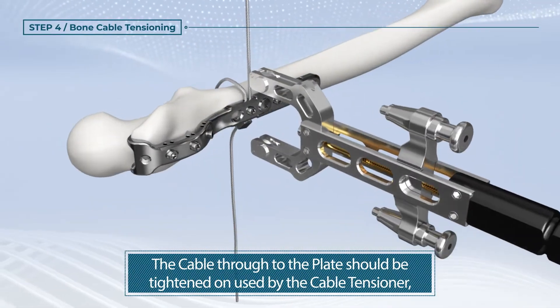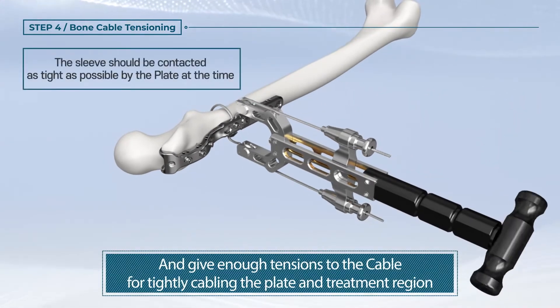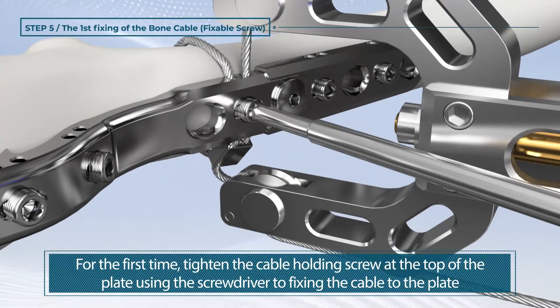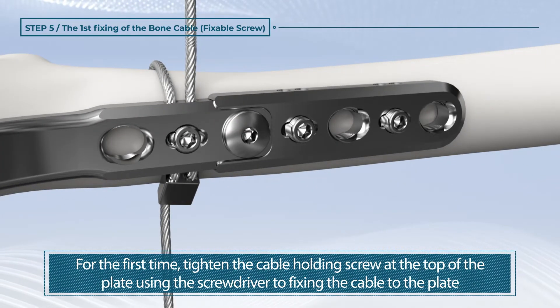The cable through the plate should be tightened using the cable tensioner and give enough tension to the cable for tightly cabling the plate and treatment region. For the first step, tighten the cable holding screw at the top of the plate using the screwdriver to fix the cable to the plate.